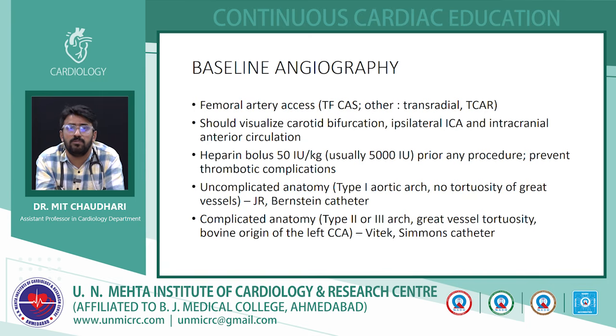So usually we get a femoral artery access, that is transfemoral carotid artery stenting, but transradial is also explained, and there is direct transcarotid artery revascularization, where we give a low neck incision and we open up the common carotid artery, and directly from there we access the carotid artery. So this also has been explained.